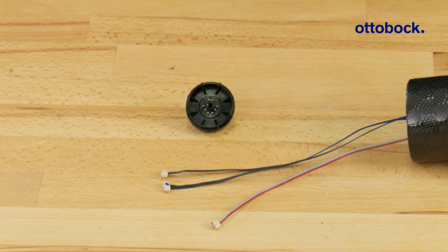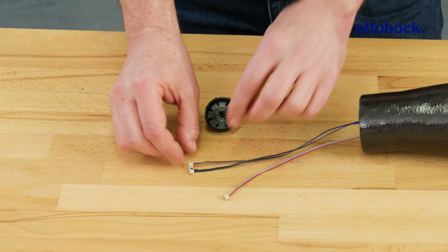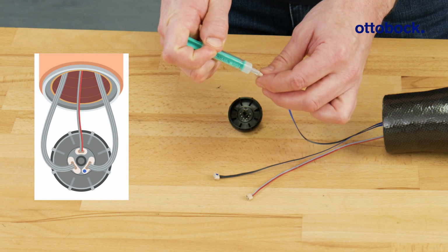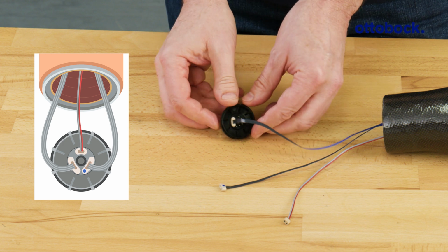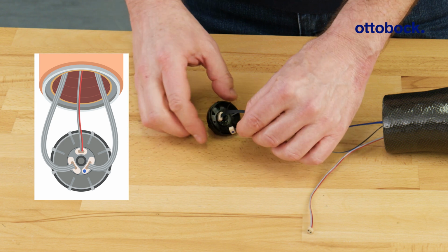Position the coaxial plug so that the 2-pin contact is at the top. Next, apply silicone grease to the 3-pin cable without the dot, and plug it into the left contact. Then, grease the 3-pin cable with the blue dot and plug it into the right contact.